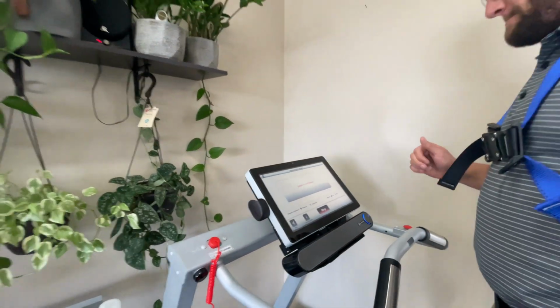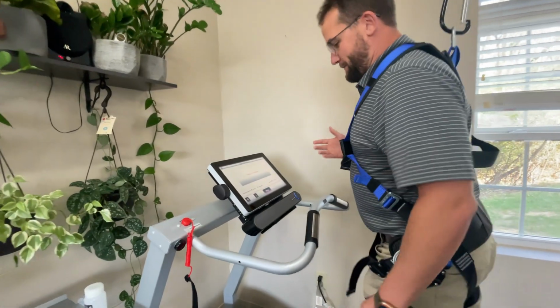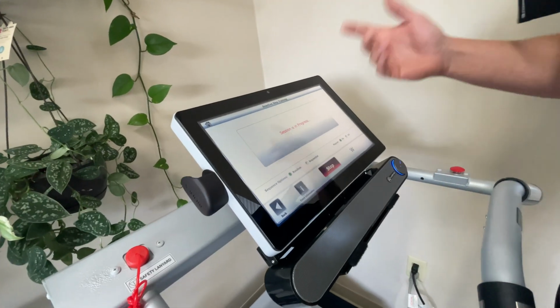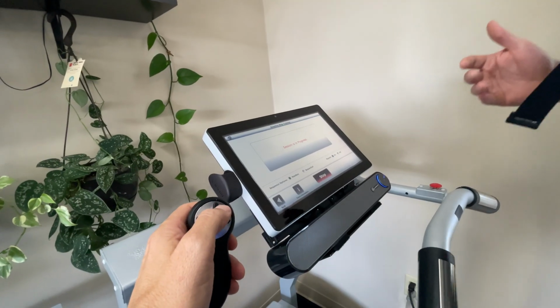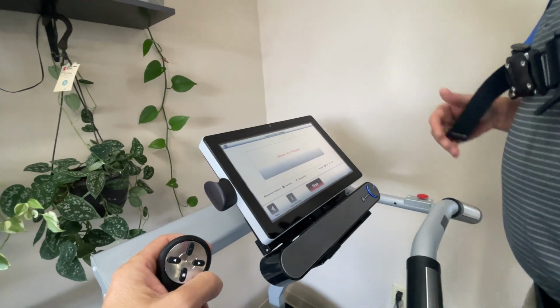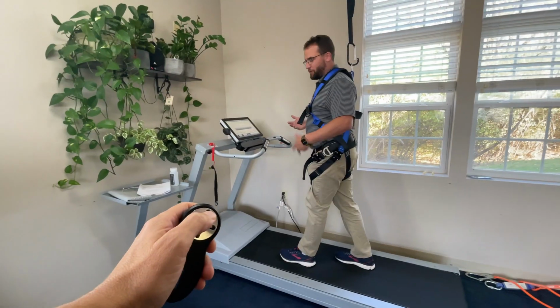All righty. Now, the sequence options are on random. It can repeat. Oh, so that's what it did. It walks and then it slows down. So it gives you a few minutes, and then what Tony's going to do is he's going to hit the button again. It's going to give me a chance to catch my balance, walk out a couple steps. The belt's going to come to a stop, and then he is literally just controlling it by the remote.